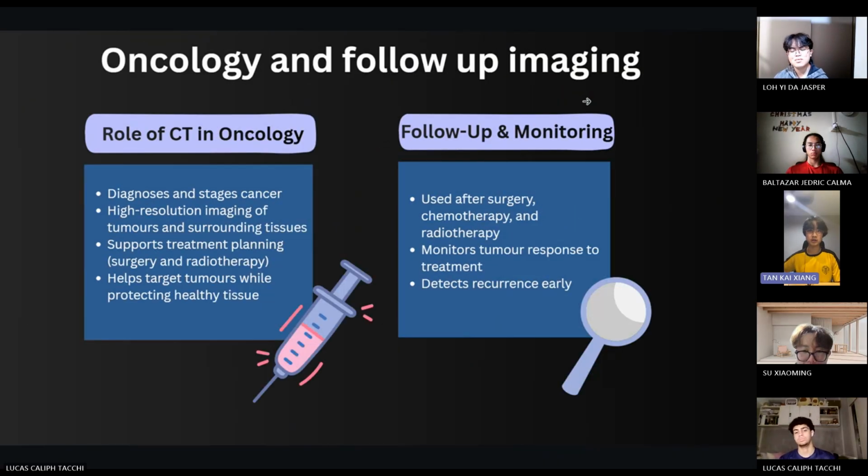In oncology, CT is used for cancer detection, staging, and treatment planning. It helps guide surgery and radiotherapy while protecting healthy tissue. CT is also used in follow-up imaging to monitor treatment response and to detect recurrence early.